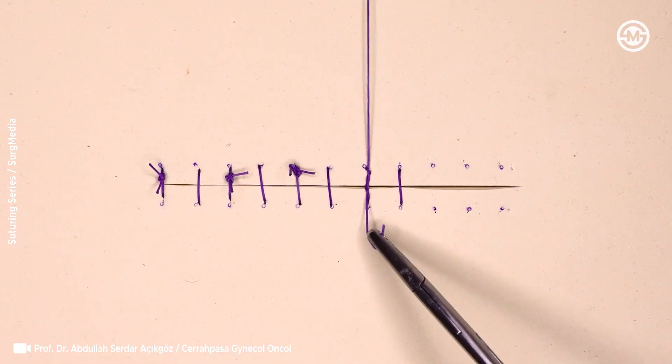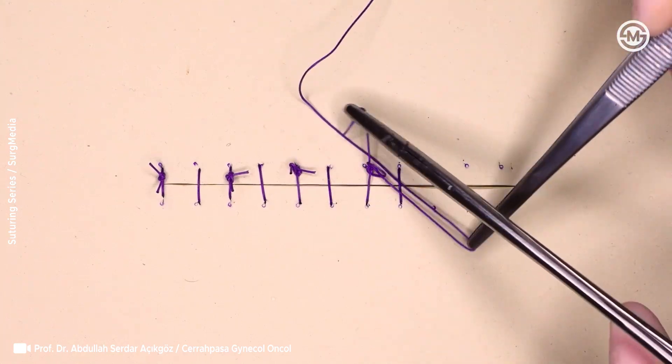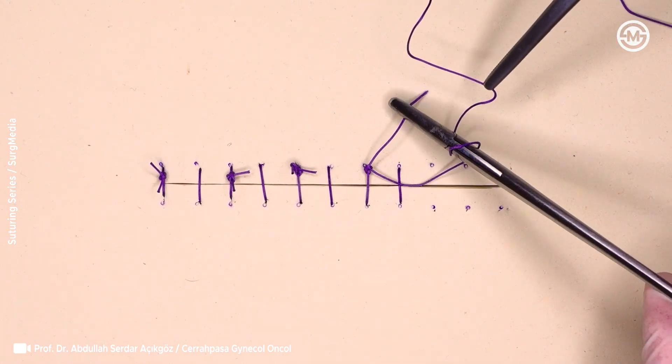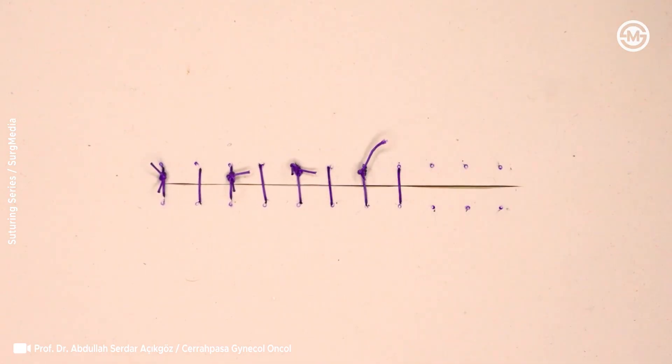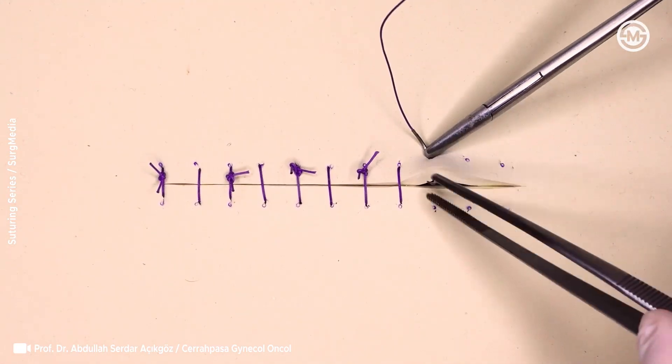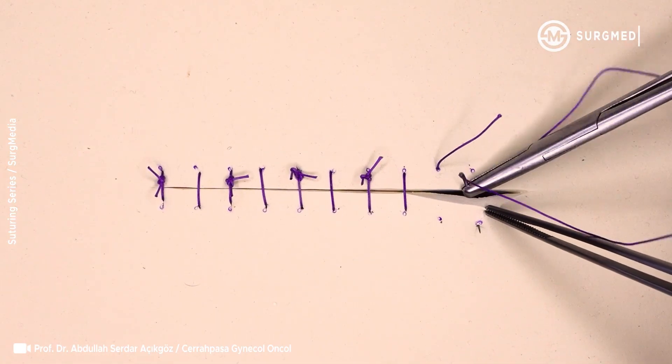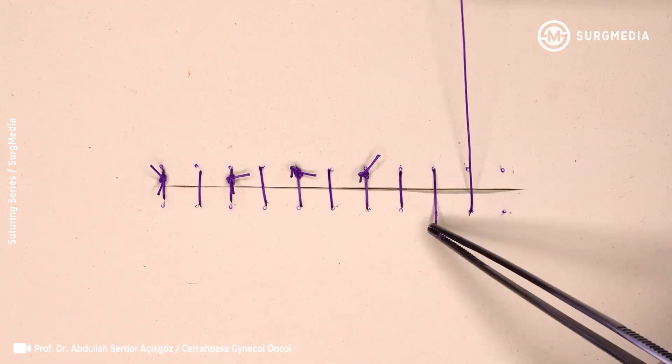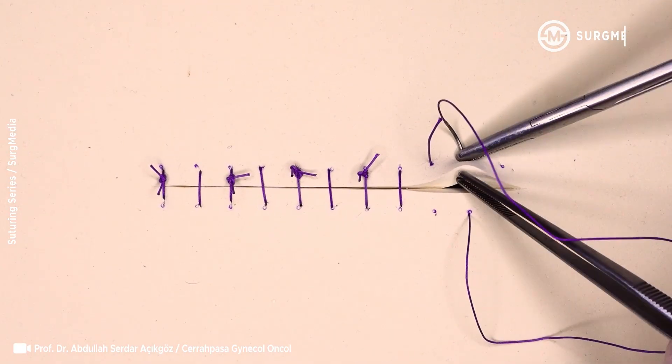Surgeons typically prefer absorbable sutures, such as 4-0 or 5-0 Vicryl or Monocryl, for buried dermal sutures, since these materials provide good tensile strength and reduce the need for suture removal. For superficial skin closure, non-absorbable options like nylon or polypropylene may also be used, depending on the location and cosmetic needs.